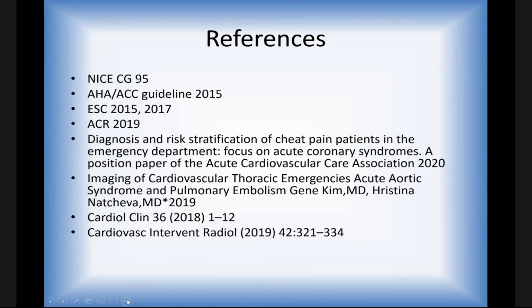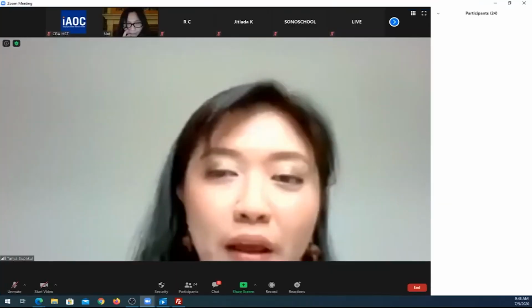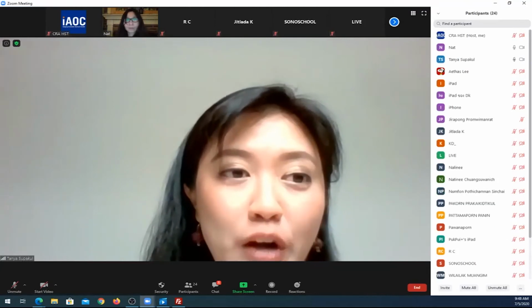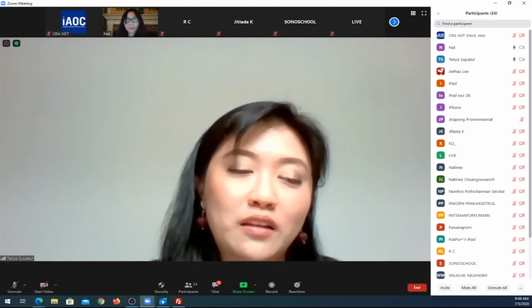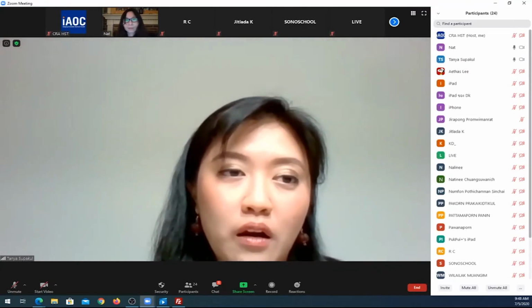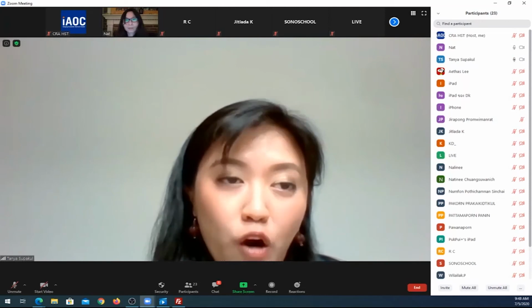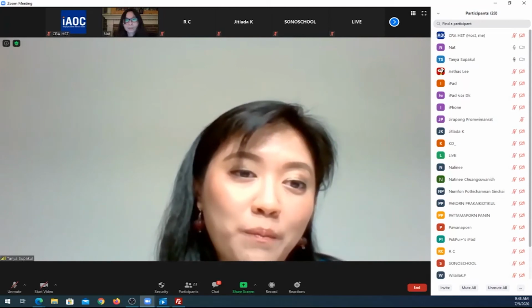So I have a couple of questions. You mentioned dual energy and spectral CT, and you said when you have good contrast tracking, you get good image quality, so you don't need dual energy. But when you don't have good bolus tracking, dual energy or spectral CT helps on that part, right?